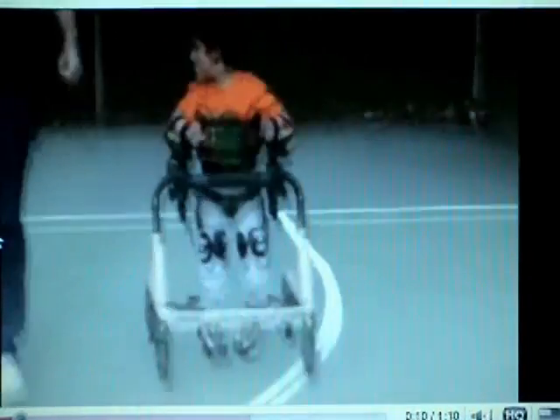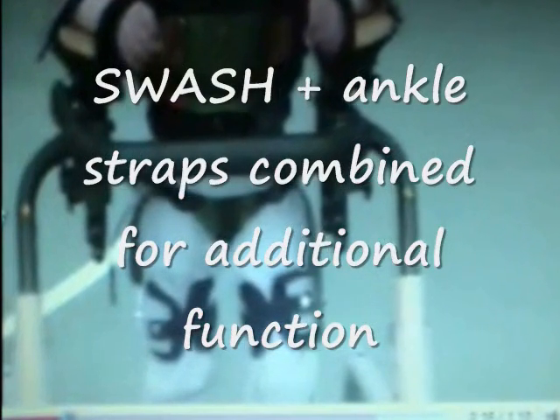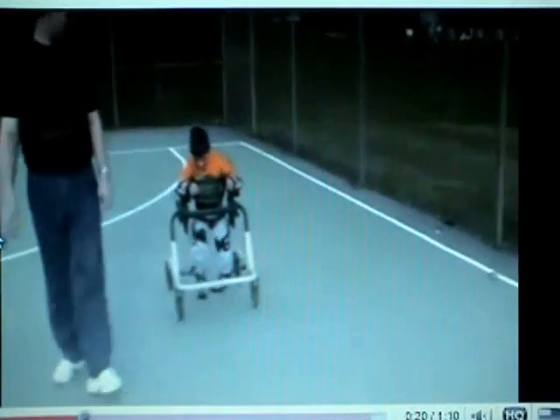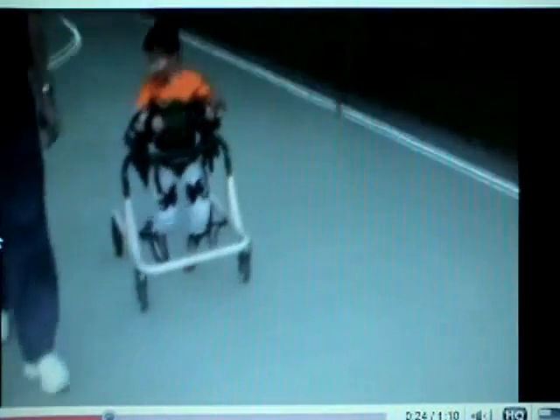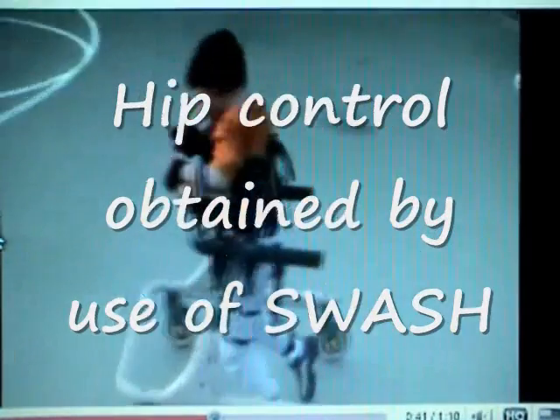We're getting closer to achieving stability in the lower extremities. This older patient is using a swash hip orthosis and we have straps at the ankle to prevent additional scissor gait. We've also stabilized the upper trunk and the forearms. Below the knees is where we're really missing a lot of stability. He's still walking on his toes — those shoes will probably have holes in them in another week or so.